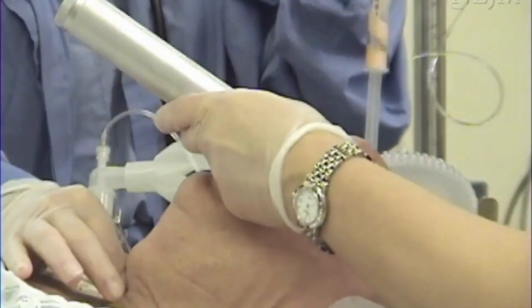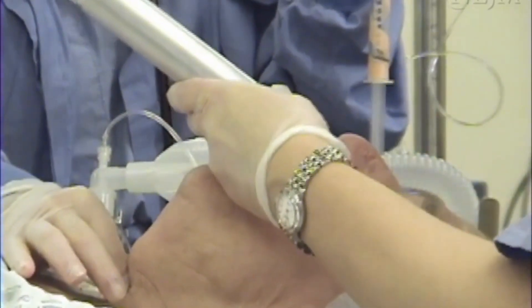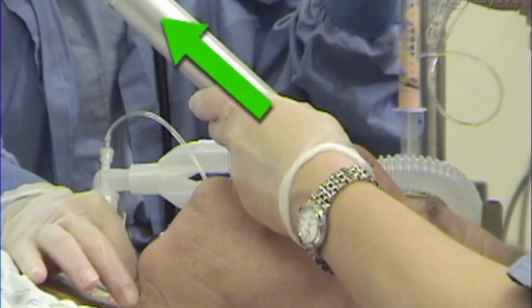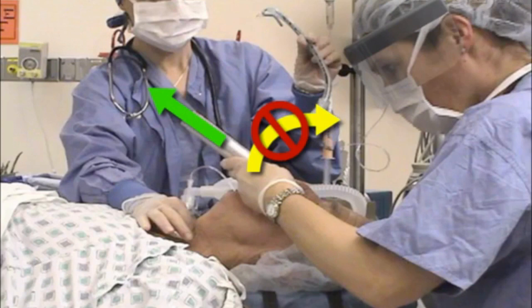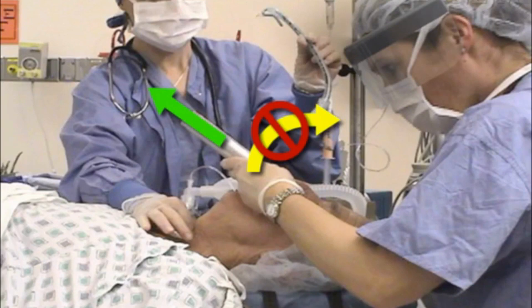When the tip of the blade is correctly positioned, lift the laryngoscope upwards and forwards at a 45-degree angle, directing the force of your lift along the axis of the laryngoscope handle in the direction of the ceiling over the patient's feet. Avoid bending your wrist or rocking the blade against the patient's teeth, which can result in dental or soft tissue injury and will not enhance the view of the vocal cords.